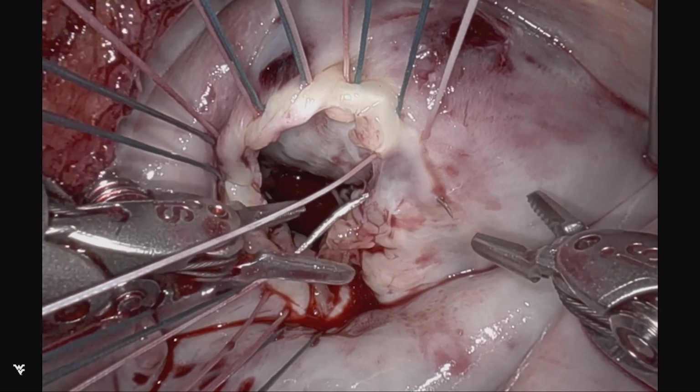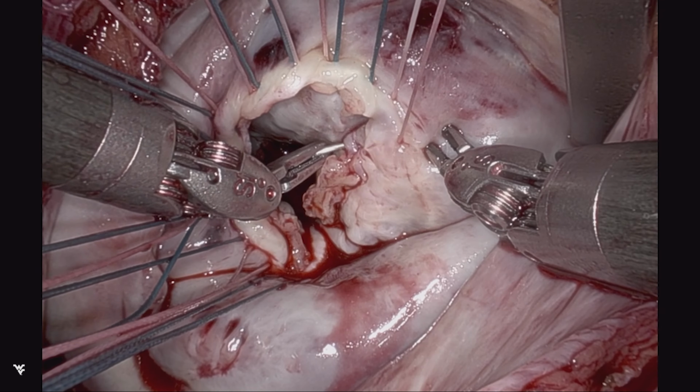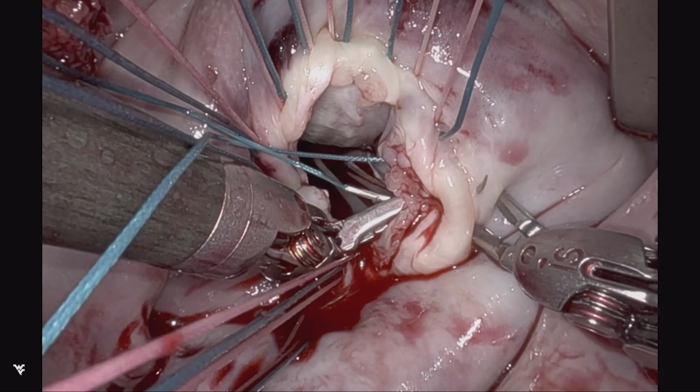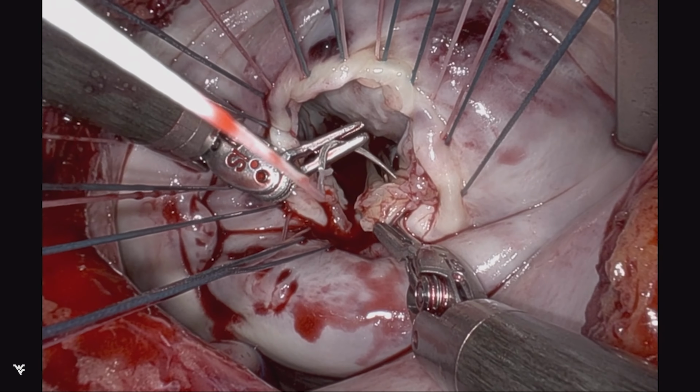As you'll note that once we go past the midpoint or the noon on the clock face, I'll switch to my left hand to do the sutures backhand. This allows the camera to remain coaxial along all of the stitches, so there's not entanglement, and it helps my tableside surgeon to help keep suture organization quite nicely.